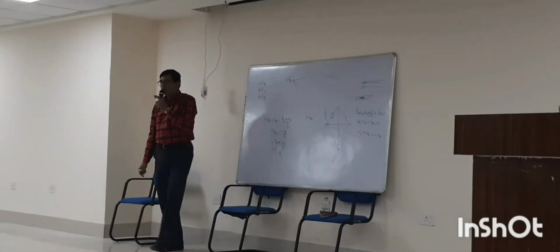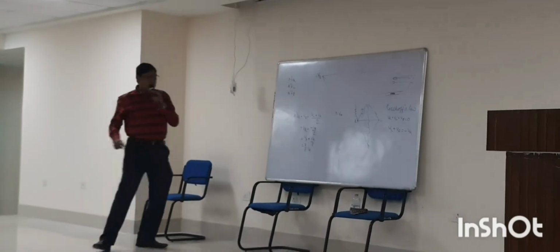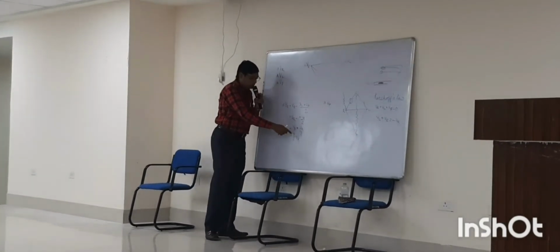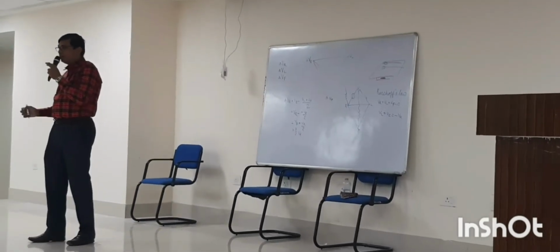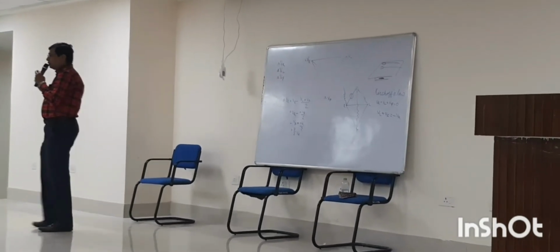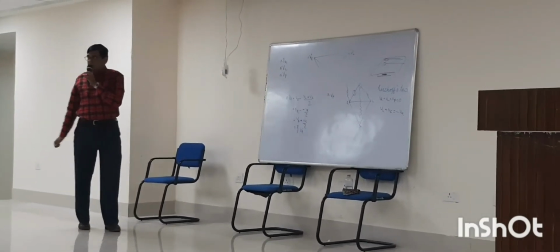Look, by detaching the attachment, the voltage difference becomes 3 by 2 times VR. So it is augmented. That's why it is called augmented limb leads. So there are 3 augmented limb leads: AVR, AVL, and AVF.